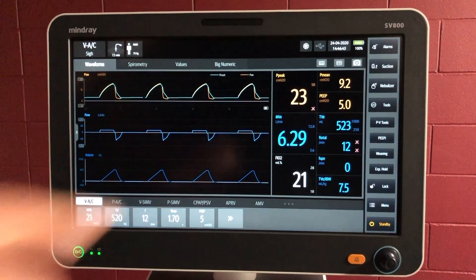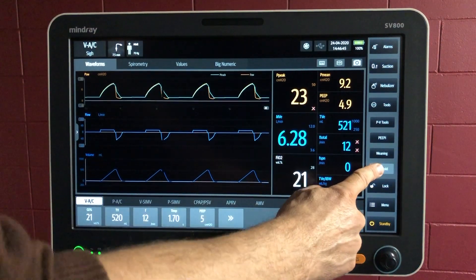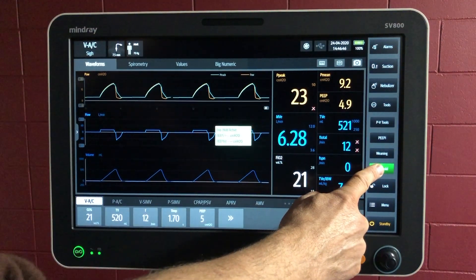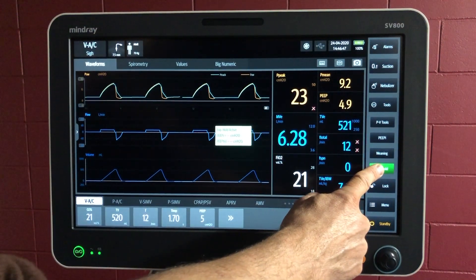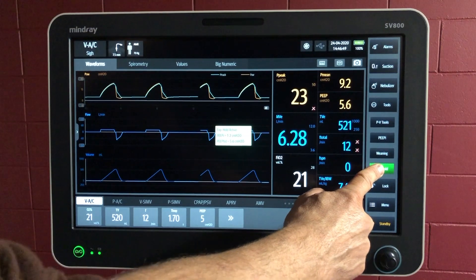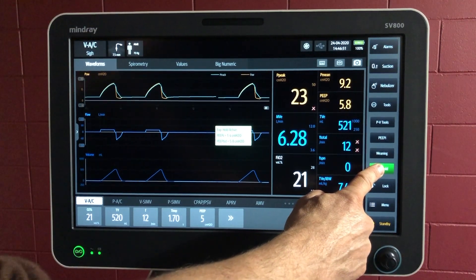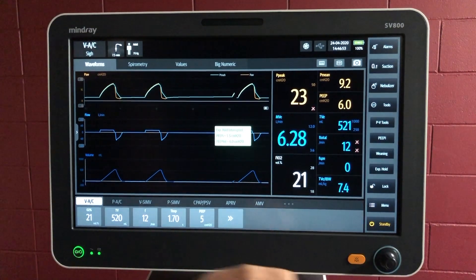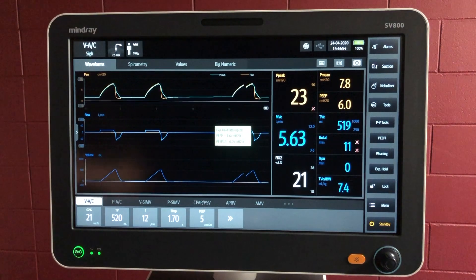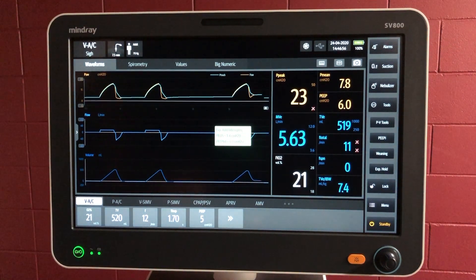Let's try out that expiratory hold — measuring intrinsic PEEP. That measurement will come up on the screen as well, you can see that. As I let go, the ventilator starts breathing again.